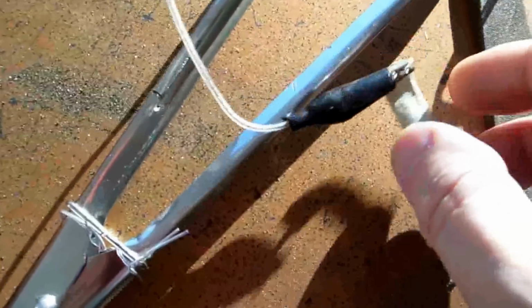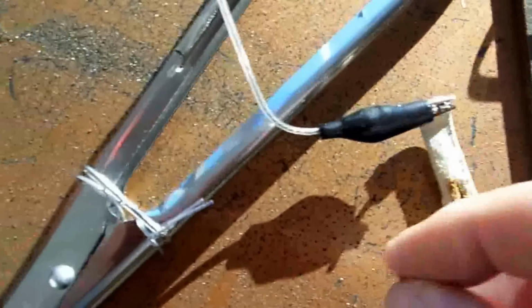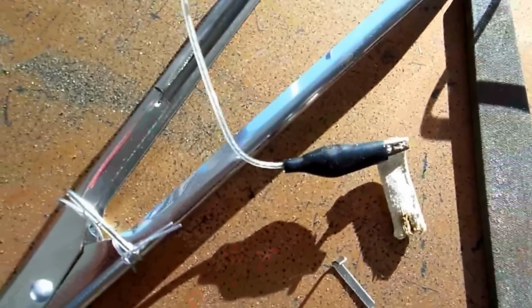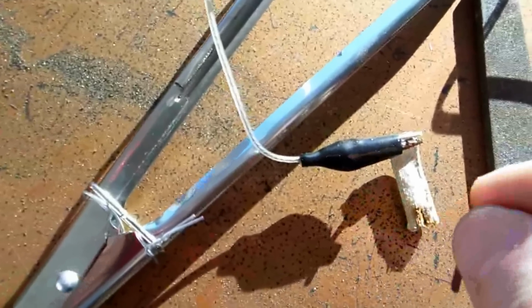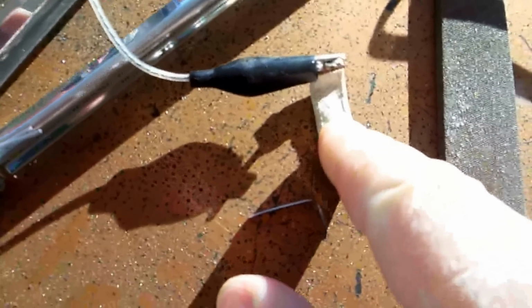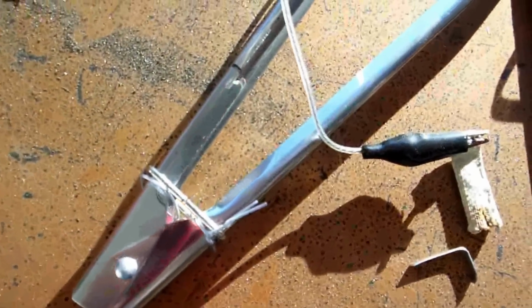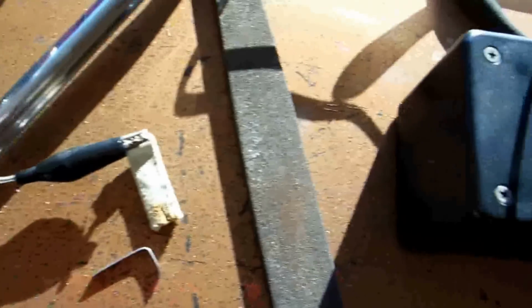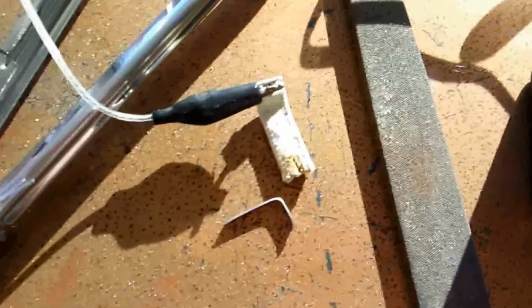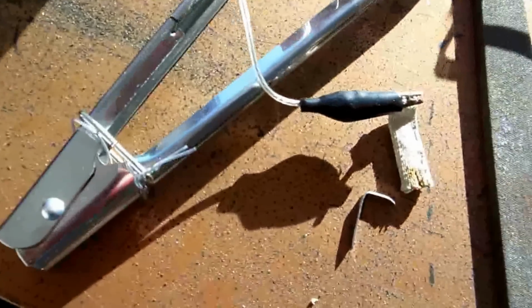So sometimes with some of these little details, you're wondering how the hell you make these damn little things here. This is what I used. I used some tongs, and I got them out of Walmart. They're stainless steel. They're not steel. They're stainless steel, because this thing is always going to be wet, right? So you don't want steel, it'll rust. So stainless steel, and 97 cents. Basically that's a little modification that you can use, and you want to have them, like I said, to the specifications that Dr. Beck said.